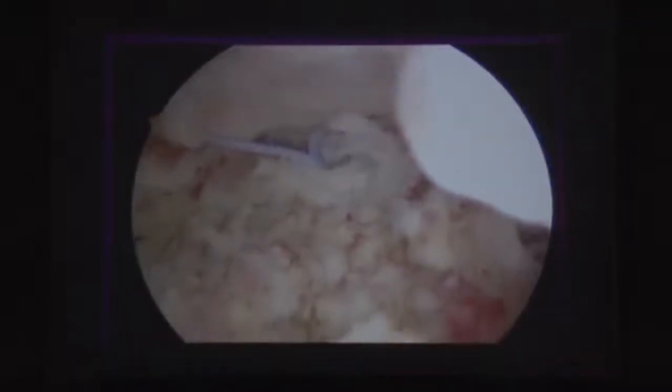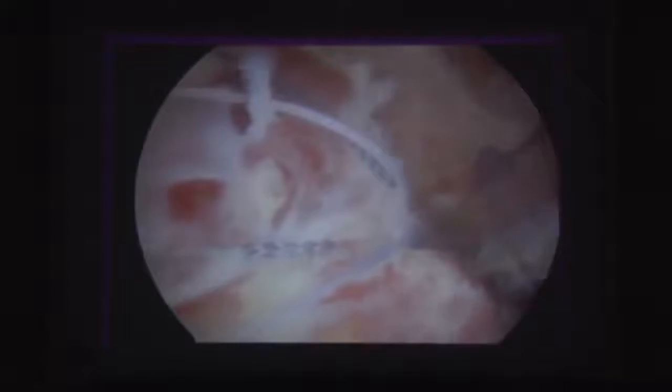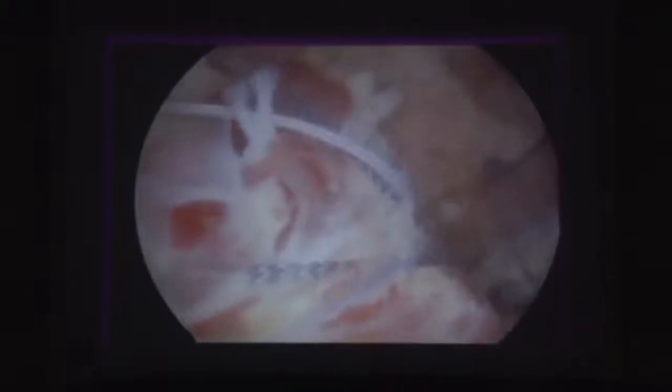Two medial row anchors are placed and sutures are passed exactly at the bone-tendon junction — unlike a cuff repair where sutures go through the cuff, here they come exactly at the junction of the tuberosity with the cuff. All sutures are taken in mattress configuration. With traction, the bone piece sits down anatomically. Knots of the medial row are tied down, and the fragment is brought into the lateral row, at least five to eight millimeters beyond the crater for true anatomical reduction.